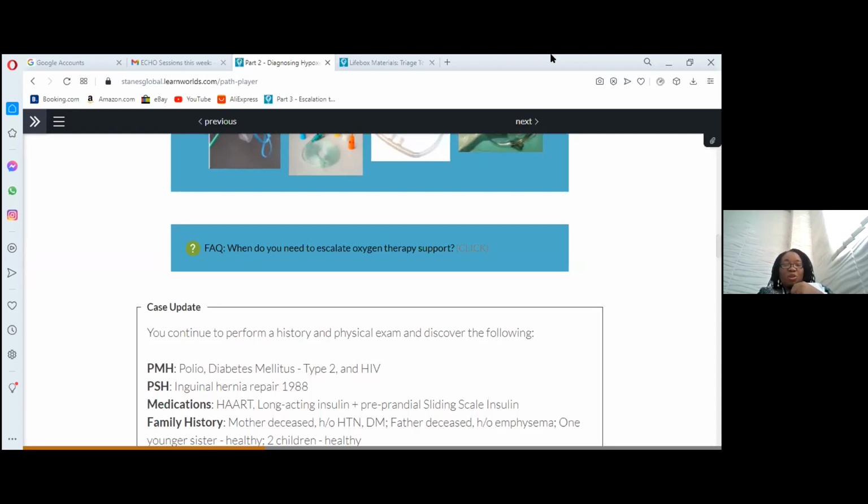So understanding how much saturation and how much FiO2 you can achieve with the devices above will help you know what to do. You have your pulse oximeter giving you the values, and you know your desired value is above 94. Now you have your devices, which you should understand.